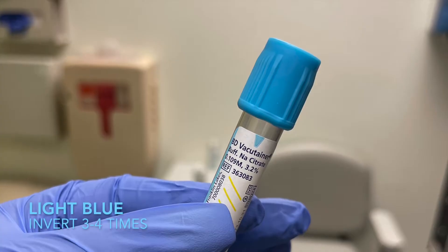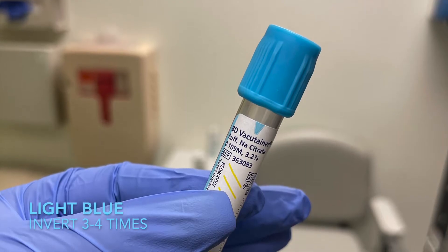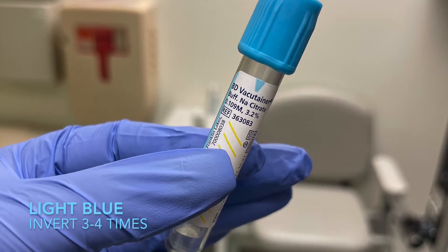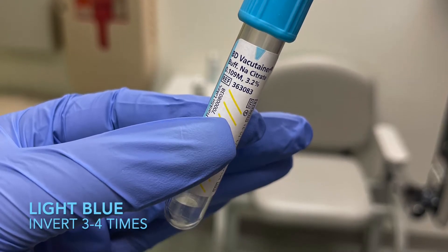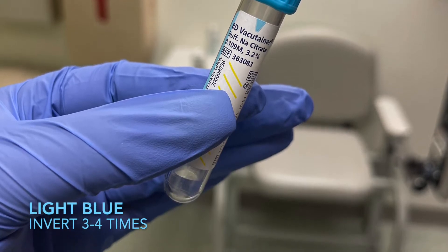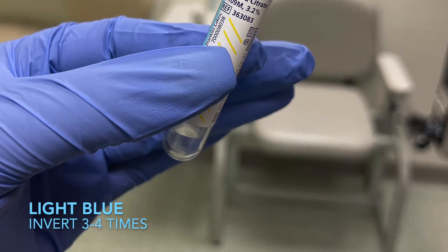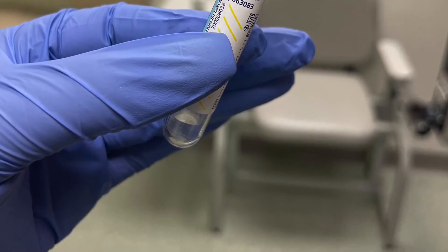It is really easy for the blue top to get clotted, especially if you're using a butterfly needle and the blood is taking forever to come out — just go ahead and do a redraw at another site. The vial must be filled to the line so coag can test it properly; if not, it will be rejected. Do not use any other tube as a waste tube with a butterfly, as you don't want other additives contaminating the vial. Tests included are heparin assay, PT, PTT-INR, and a DIC screen.